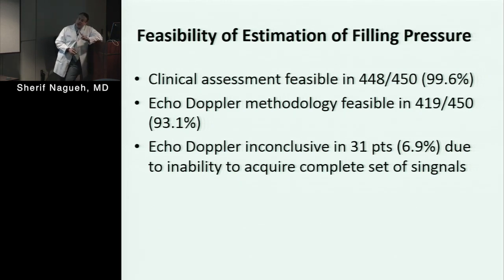So two cases were felt not enough info. Again, remember, these are cardiologists looking at these charts. Don't show that to an insurance company, they're going to say that you don't need an echo at all. That's a good question. You will see how that performed. Feasible meaning that they felt they could do it, not necessarily that they were accurate. Yes.